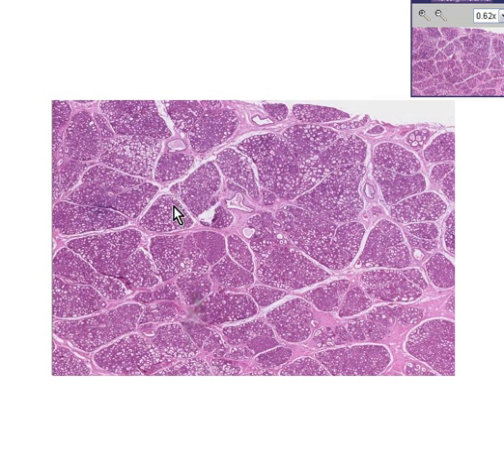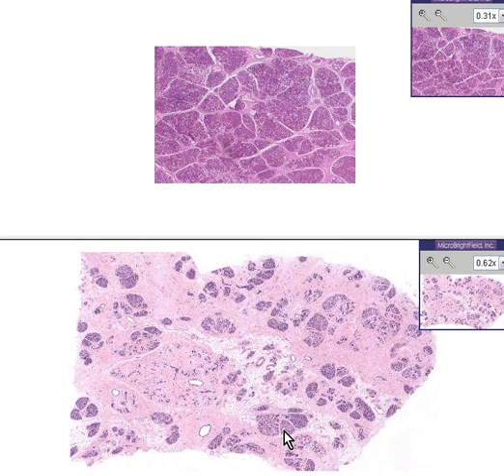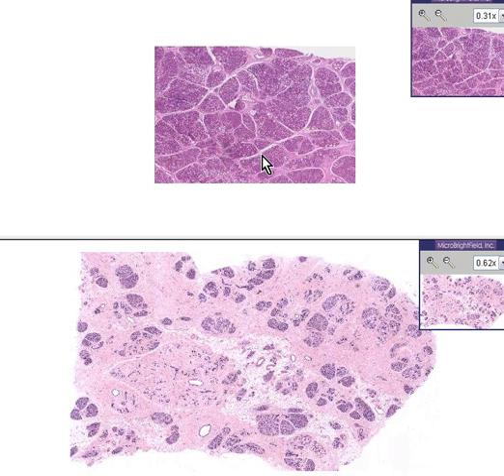Now we have a breast in which you could still see preservation of the lobules, but the lobular or glandular element is about 90 — perhaps more — percent of the gland itself. Here is a normal breast. Notice that the ratio between these lobules and the fibrous tissue is about 50-50, but in the above you still have preservation of the lobules with the lobules comprising about 90% of the breast tissue.